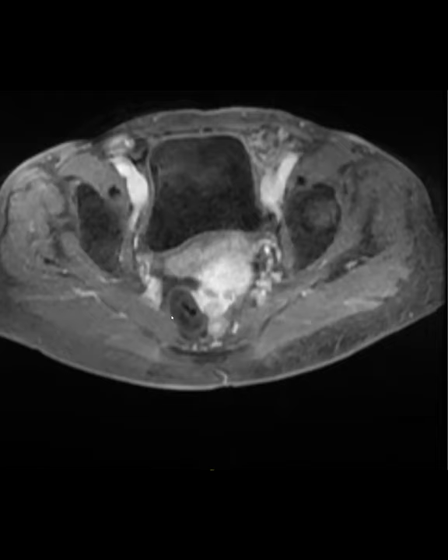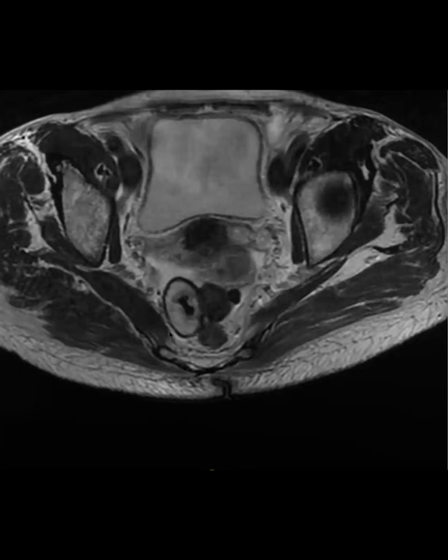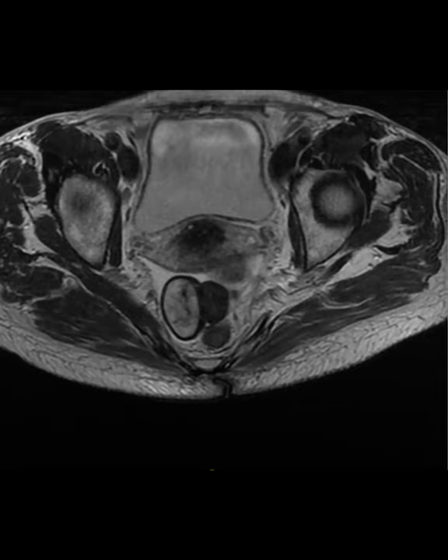Well, it's separate from the adnexa, so it's not a dermoid. It's attached to that structure that's attached to the uterus, so it's uterine origin. But you're correct, you don't need fat to diagnose. The other thing is you don't need bulk fat, so you have to look at the in and out of phase and see if there's intravoxel or microscopic fat too. Oh, I'm sorry. Cookie, what did you say?